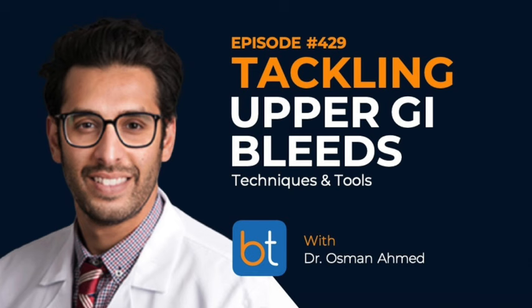But a big, long coil, like a Nestor, oh gosh, those make me nervous now. You know what I mean? Totally. And like you said, the new coils on the market now, the lengths, the variety of sizes, the ability to essentially place them like they're wires, like they just come out so soft. Yeah. It's been revolutionary, or game-changing.